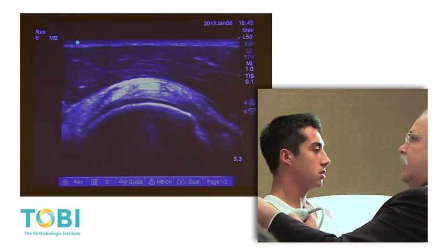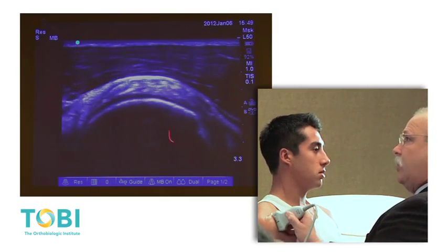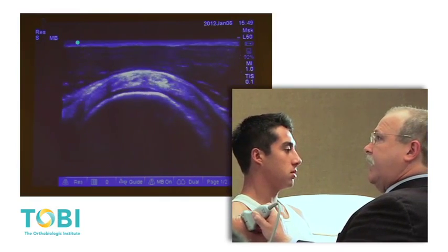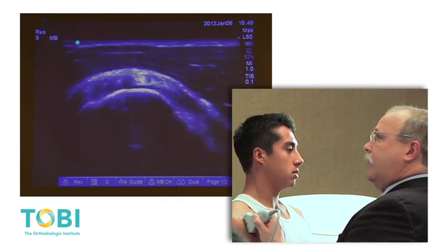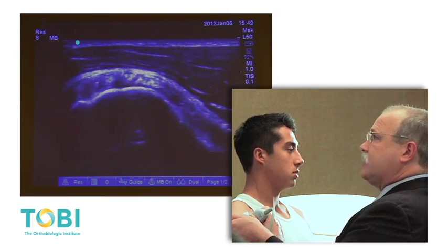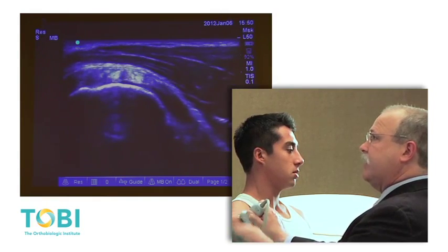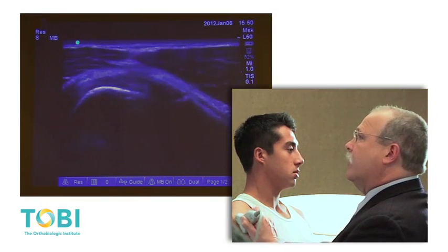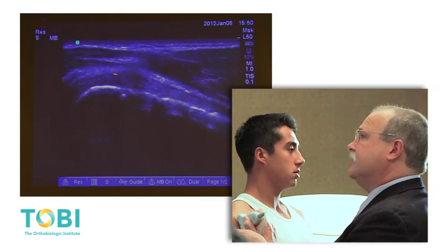Now we're just in the tendinous portion of the subscap, still over the humeral head. I know that because we're seeing articular cartilage. Working out, advancing more distally. Now I'm over the footprint of the tuberosity, and you're starting to see those tendon bundles. See those zones of anisotropy in between the tendon bundles of the subscap. Now I know I've cleared the subscap when I get to the biceps tendon in long axis.